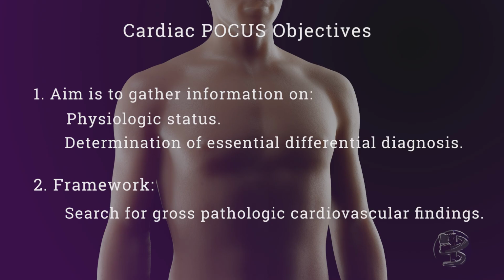We are looking for specific targets. This exam is not meant to be exhaustive, as is the case of the TTE exam, where we are looking at conclusive diagnosis and monitoring of cardiac disease. When the findings of the POCUS exam are not conclusive, then referral to the comprehensive exam will be necessary.